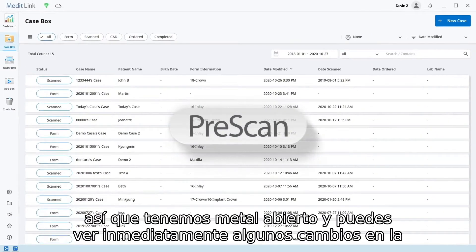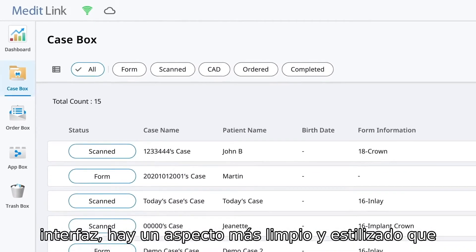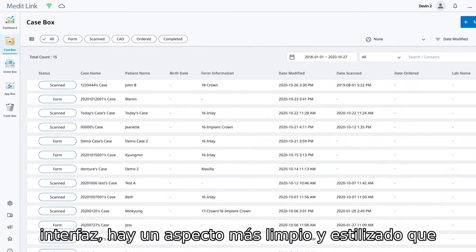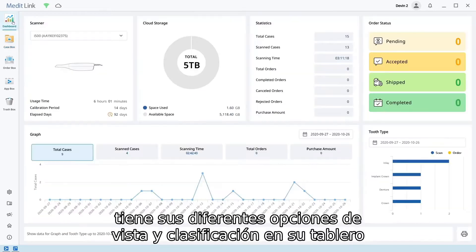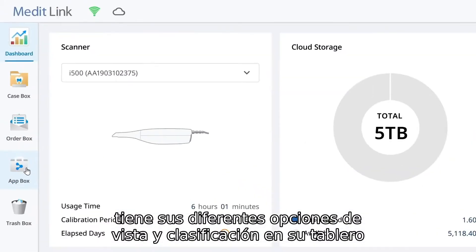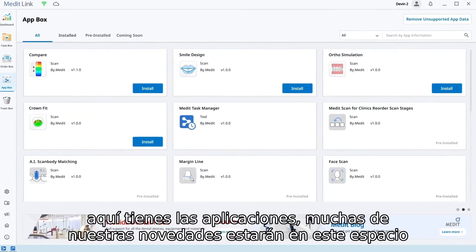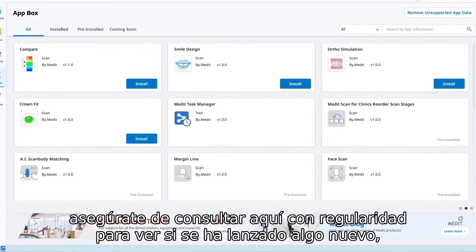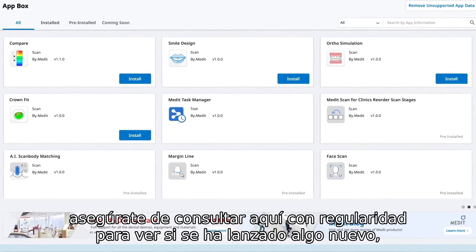MediLink is open and you can immediately see some changes to the interface. There's a clean, more styled look. You have your different view and sorting options, your dashboard, and here you have your applications. A lot of our new features will be in this space. Be sure to check here regularly to see if anything new has been released.